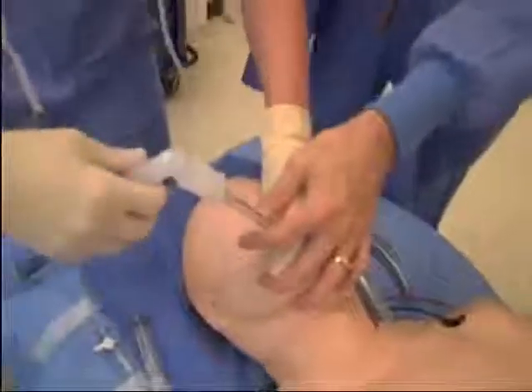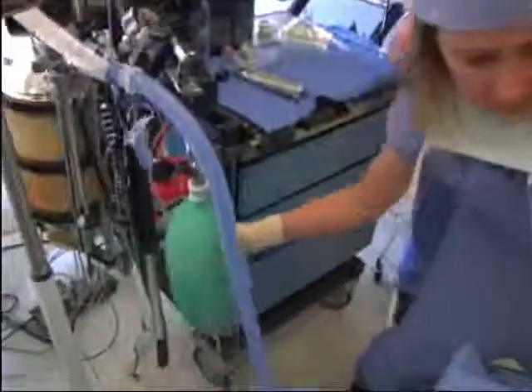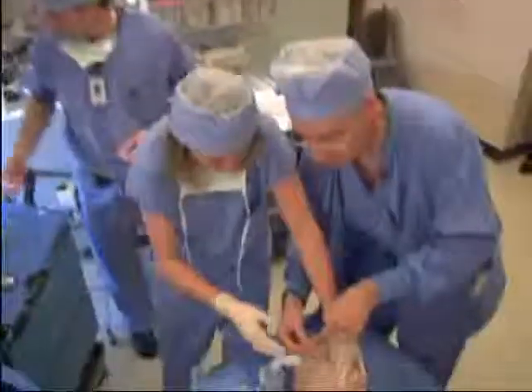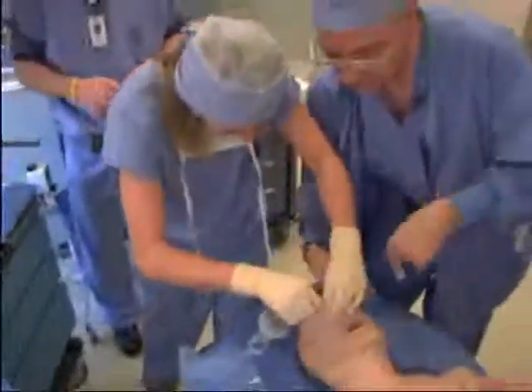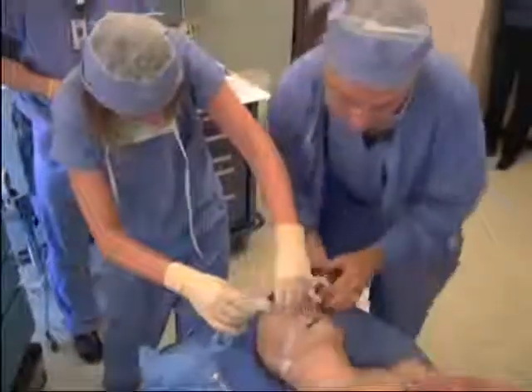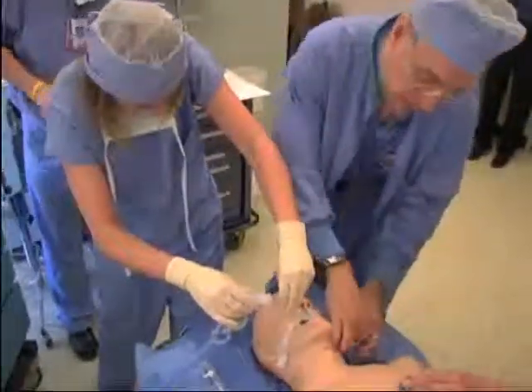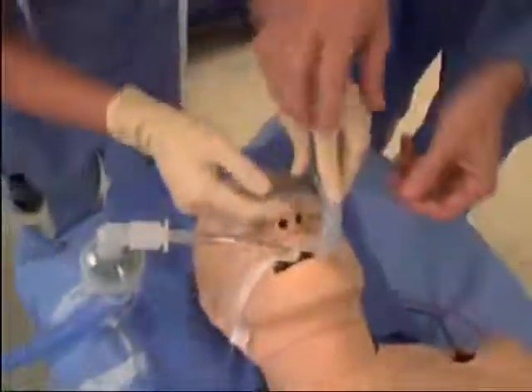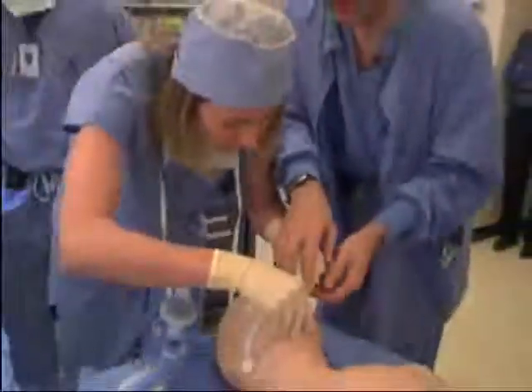Okay. And then squeeze back that bag over here and see if its chest goes up and down. Oh, perfect. Let's open the bag up so it doesn't get too inflated. We're going to tape this tube, so now grab it up here. Okay. And I'll tape this in, because you don't want this to come out. If this comes out, it's nighty-night. This is the thing that's going to keep him alive. We're going to put this little bite guard in here. And so put that down like that and twist it around now.